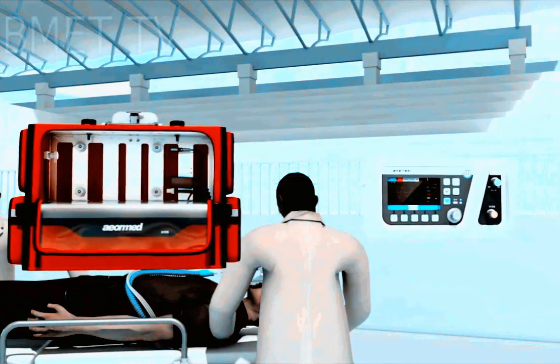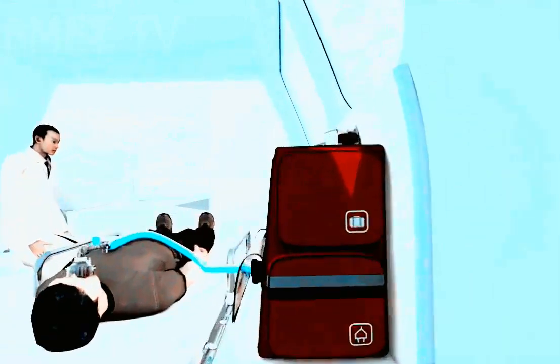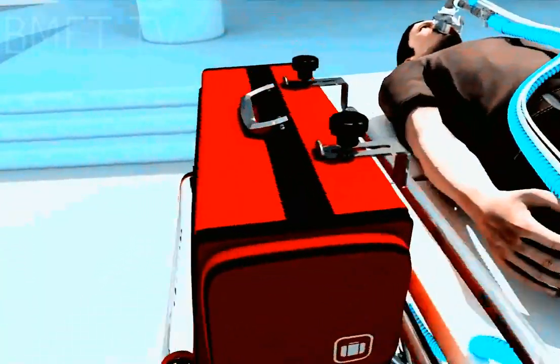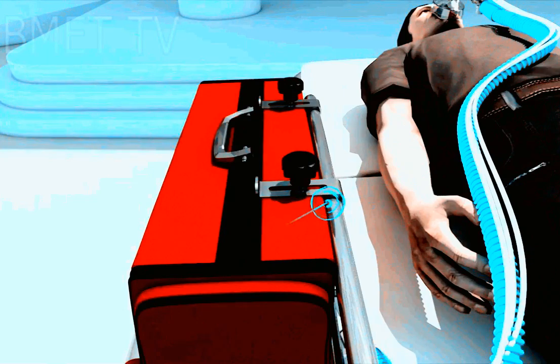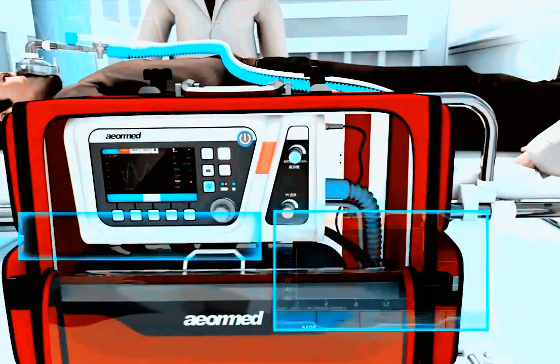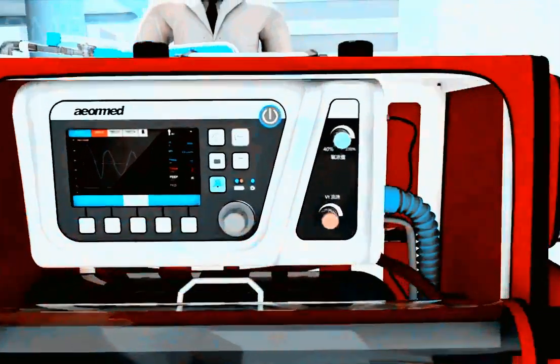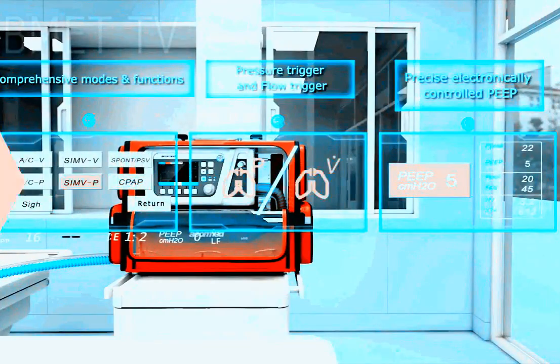These units typically consist of a flexible breathing circuit, a control system, monitors, and alarms. Power is typically supplied by one or more internal batteries, an external battery, or an alternating current line. Common operating modes available on these units include control mode, assist control mode, and SIMV mode. Some may have additional operating modes such as CPAP and pressure support to facilitate patients with more complex oxygenation and ventilation requirements. The next classification of the ventilator is the high-frequency oscillation ventilator.